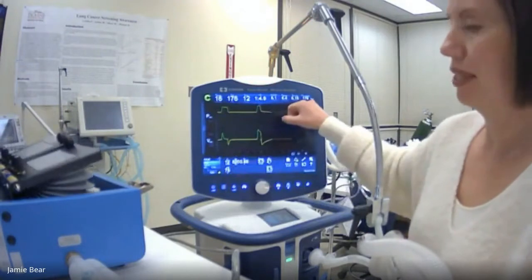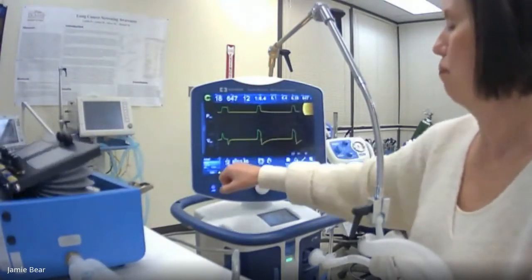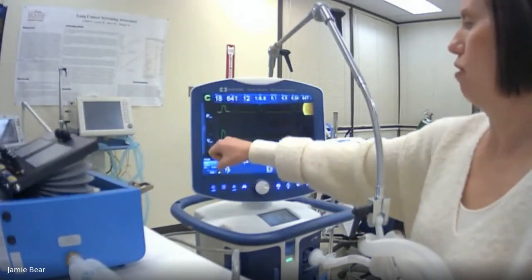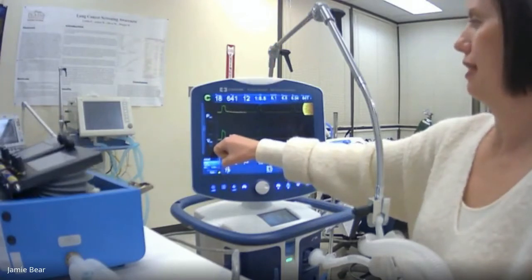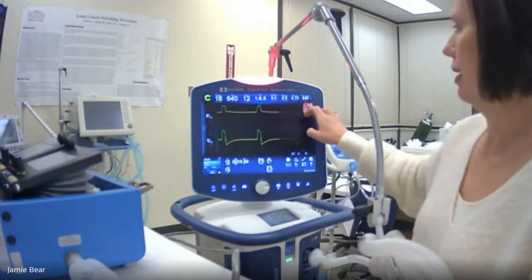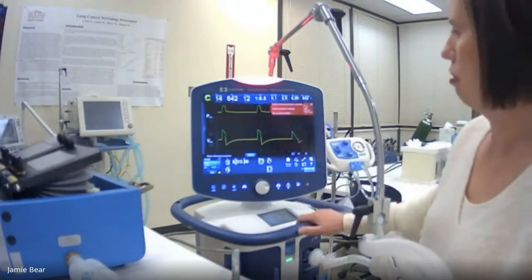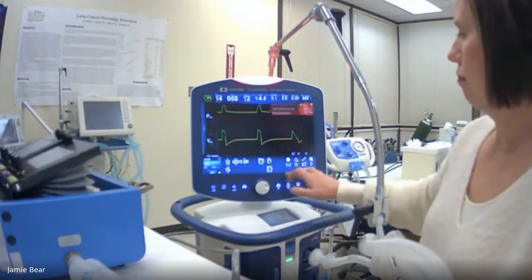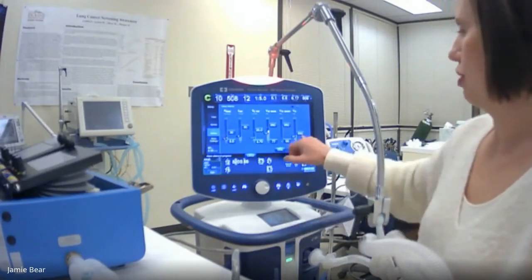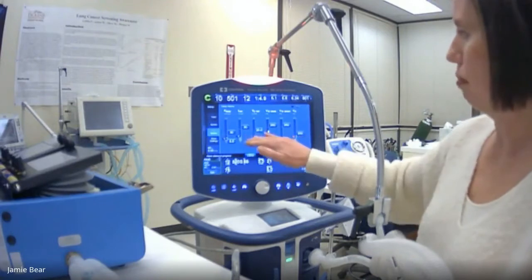Okay, now there was a spontaneous one. We didn't like that because it said high inspired tidal volume. So there, because we have that set tight. So here we go. See, now our flow is changing. Okay, so as I change, and it's just saying high inspiratory tidal volume, I'm going to silence this, and we always want to check our alarms as we adjust anything. So as I said, that's really tight, which is good. We want that. It's right there at 650, saying don't go above 650.